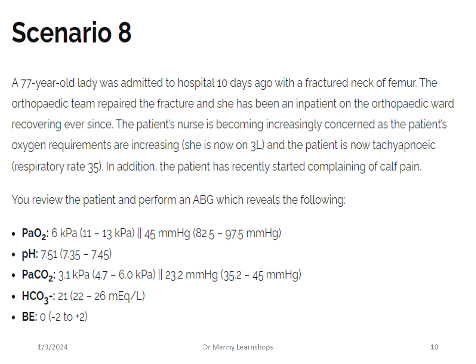Okay, scenario 8. You've got a 77-year-old female who was admitted to the hospital 10 days ago with a fractured neck of femur after a fall. The orthopaedic team repaired the fracture and she's been an inpatient on the orthopaedic ward ever since.